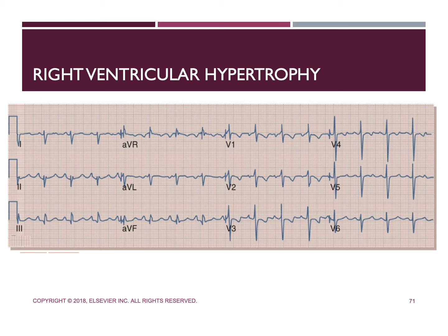We are seeing right axis deviation, as well as evidence of right atrial enlargement. I'll leave this up just for a second so you can go through this ECG strip and look at the ST depression, that R wave, and the right axis deviation in this strip here.